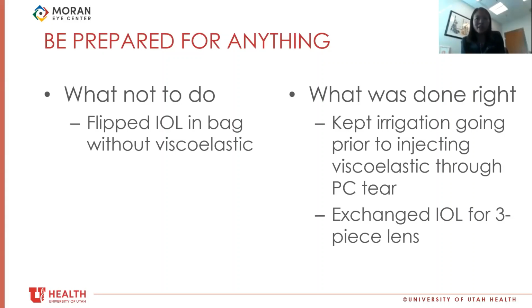It's a little bit finicky to get used to, because you have to have the forces just right so that you can still get the cyclodialysis spatula out of the fold. If you grab it too tightly, you won't be able to disengage that. So it does take some practice, but I found it to be the best for my hands. And I guess the key is making sure the dispersive viscoelastic is in the eye, so that when you have your forceps through your main wound, vitreous is not prolapsing through, right?